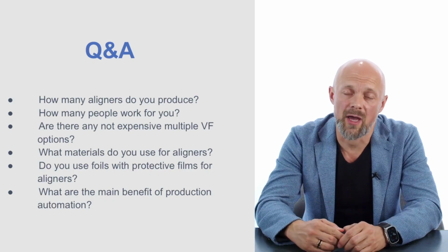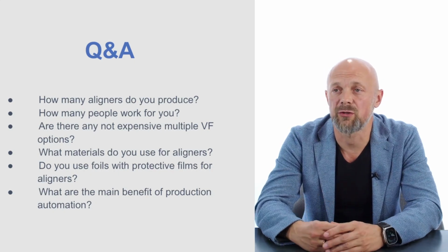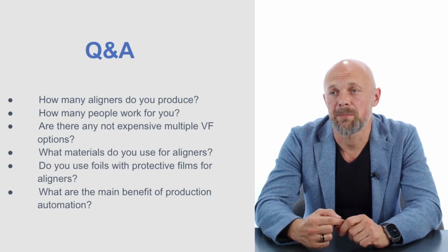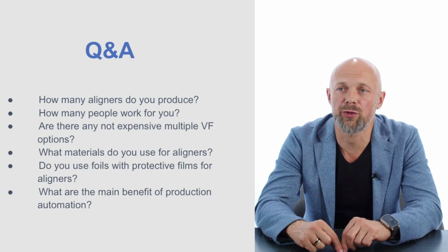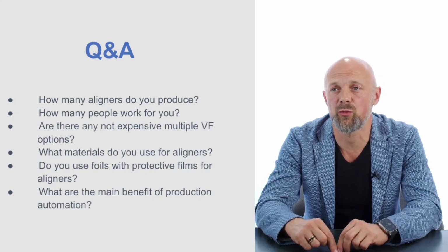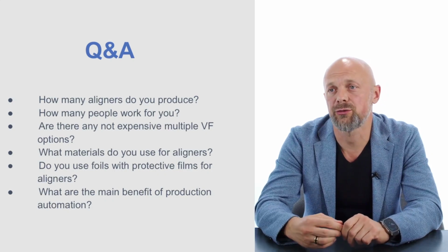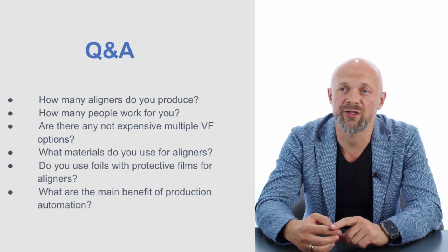So it adds additional mistakes with the aligners. That's why now we prefer to use foils without the protective films. Yes, it adds more strict requirements to the production department for model cleaning, but let's say it's doable. You just clean printed models better, avoiding sticking any composite to the aligners. So I strictly recommend using foils without protective films.